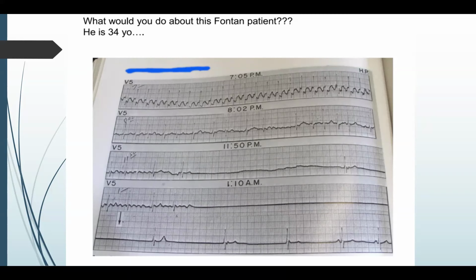Usually when we do this, it's done as an epicardial system because we're worried about paradoxical emboli. Obviously, it's very hard to do endocardial pacing in someone who has a single ventricle. Risk for thrombus and stroke is extremely high. Even doing atrial pacing transvenously is generally looked down upon because oftentimes Fontan patients have baffle leaks. Also, almost all transvenous leads develop thrombus on them, even in healthy patients. The implications are very minimal in a 2 ventricle patient, but in a Fontan, if you had microemboli going to the PAs, that could be very bad for your hemodynamics. We do sometimes do that in rare cases, but we try to avoid it.